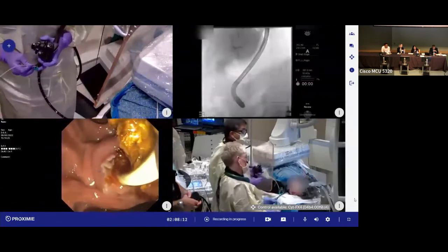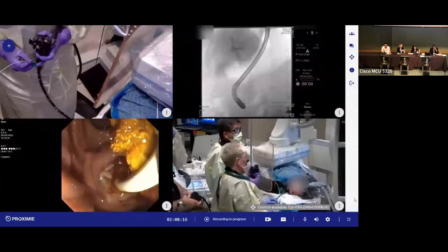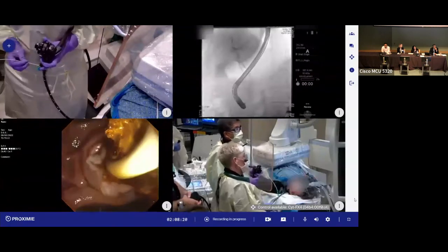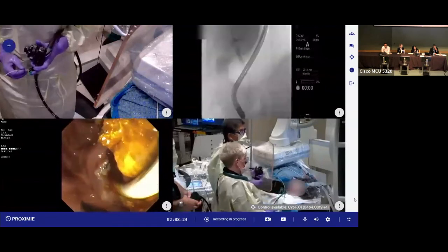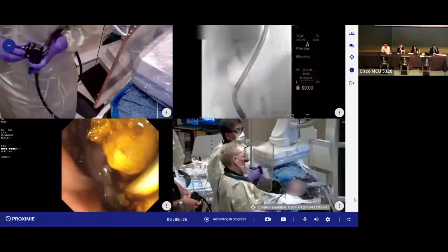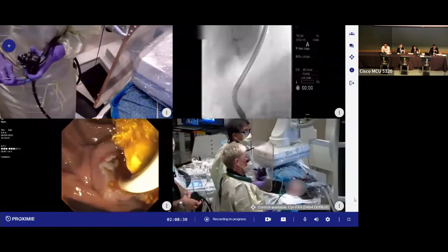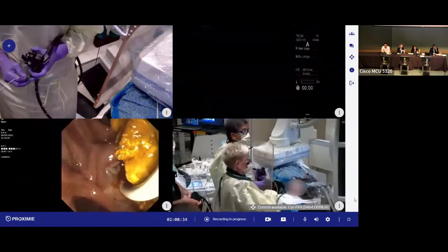Another question, Raj. I think the dilation did help you here. You got quite a stone burden, and I think it is speeding up the process in terms of delivering the stones. Yeah, I think sphincterotomy alone might have been a little frustrating. Now I have too many stones. I can almost feel too much resistance. Okay, balloon down. There's too much resistance, so I don't force it. I'm going to put the balloon down. In fact, I'm going to reassess, inject some contrast here.